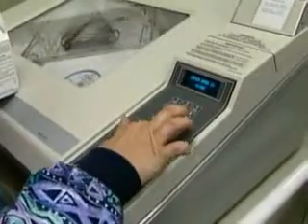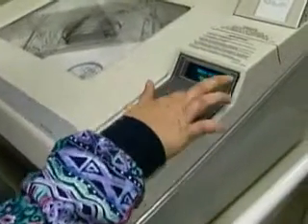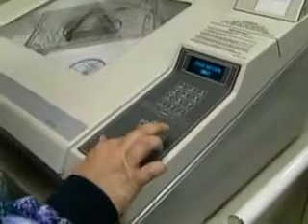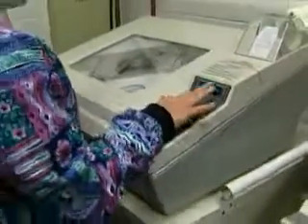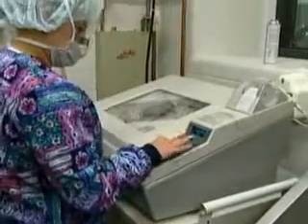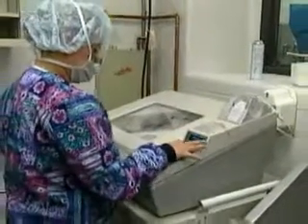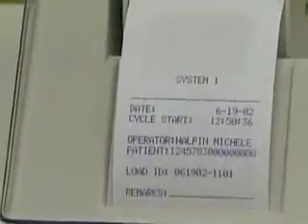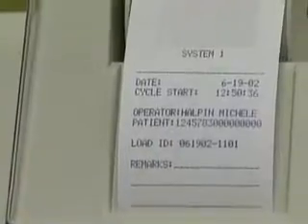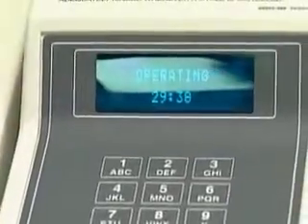All items and internal components must be completely submerged in the heated solution. When the sterilizing cycle is complete, the processed items are rinsed 4 times with sterile water, provided by tap water that is passed through a membrane filter. An internal self-diagnostic and monitoring system produces a printed document confirming that all sterilization parameters have been met during each cycle.